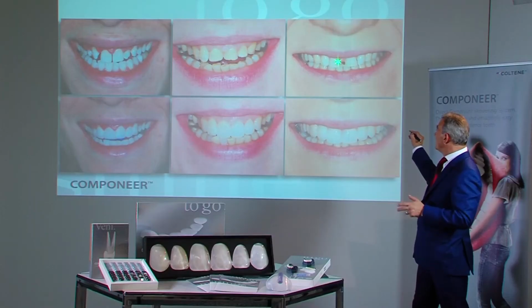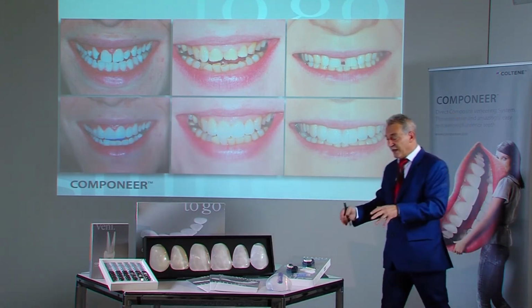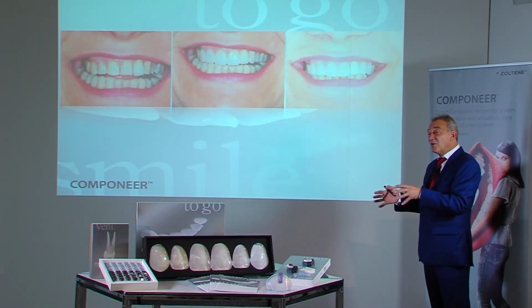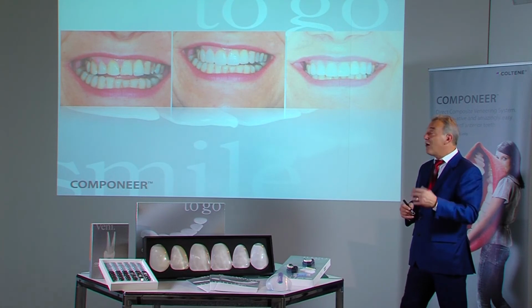However, sometimes the teeth need to be made somewhat longer. This is not a problem here, as they are too short anyway. We need to make them longer and wider to retain the proportions. This is a very important point. This is why componeer are designed as they are. If one measures the componeer precisely, one would find that they comply exactly with the golden rule. The proportion of length to width is precisely correct, which is why one can take them as a measure.